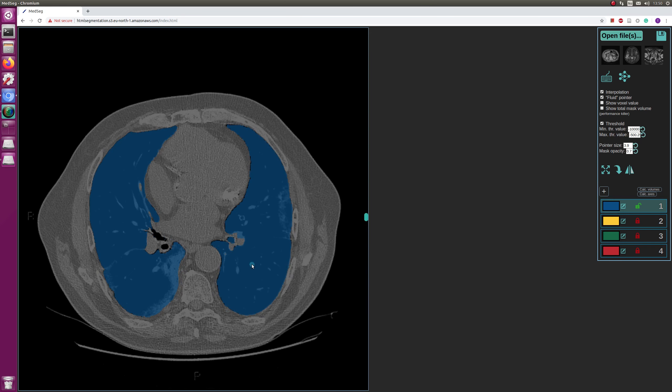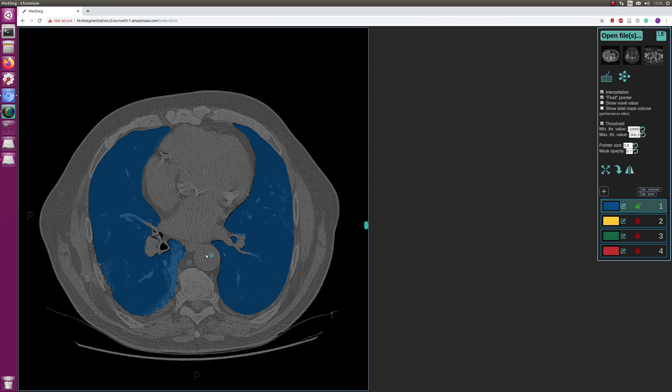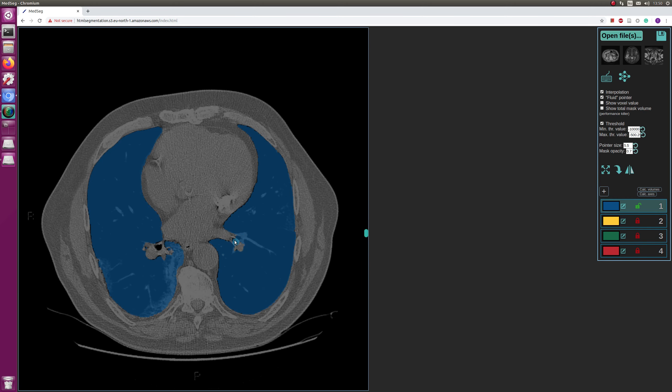I think this is starting to look quite good, actually. These are bronchi.